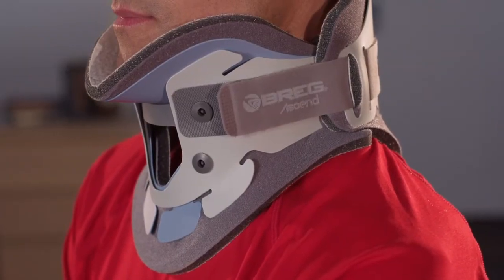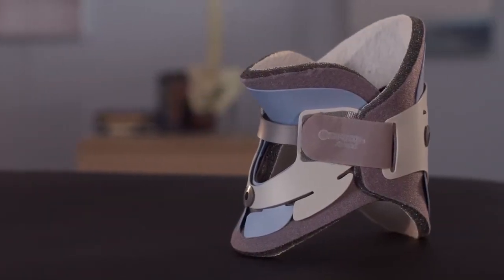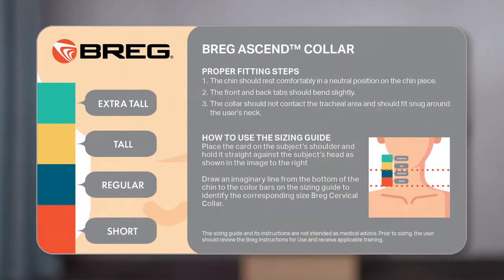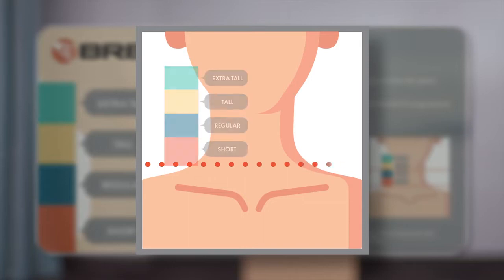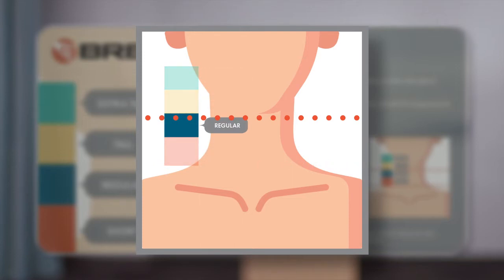The Ascend cervical collars come in four adult sizes and five pediatric sizes to accommodate a wide range of patients and anatomical differences. The first step to selecting a collar is identifying the appropriate size. For adult collars, you use the front side of the provided sizing card. You position the sizing card at the top of the trapezius muscle, and then draw an imaginary line up from that point to the patient's chin. In this case, this patient's size aligns with size regular.